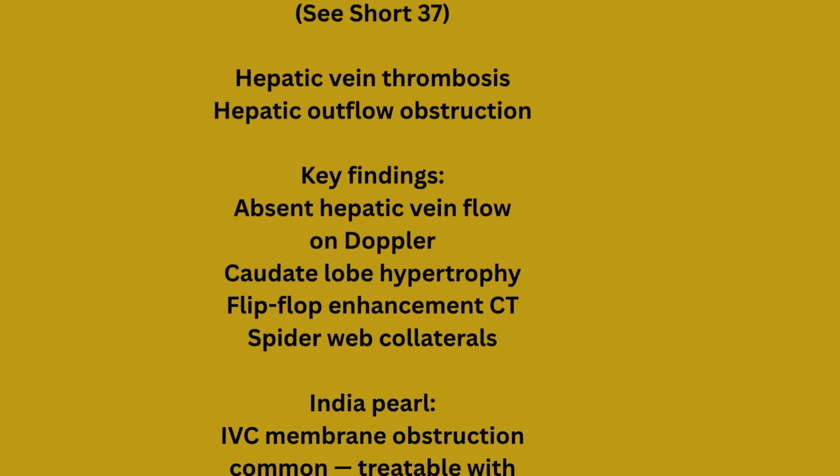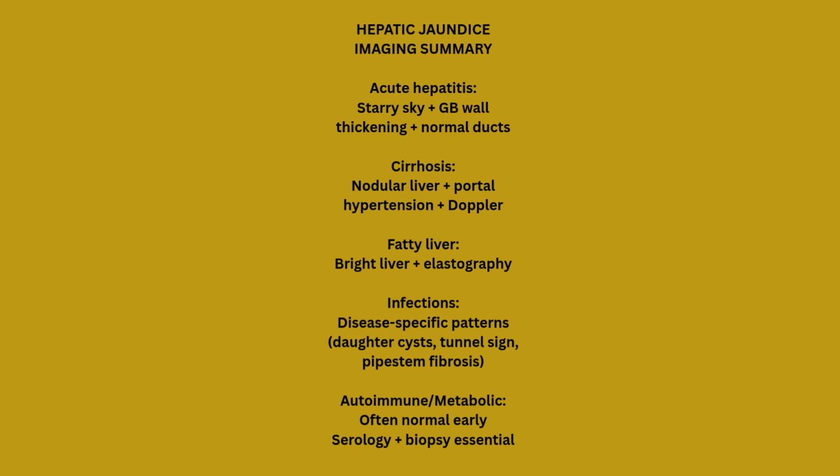Budd-Chiari syndrome: hepatic vein thrombosis, absent hepatic vein flow on Doppler, caudate lobe hypertrophy because it drains directly into the IVC. Flip-flop enhancement on CT is pathognomonic. Spiderweb collaterals in chronic disease. India-specific pearl: IVC membrane obstruction is common and treatable with balloon angioplasty. For details, see Short 37.